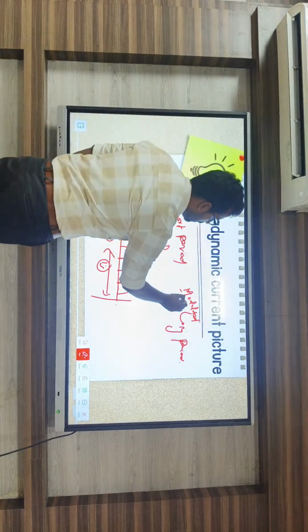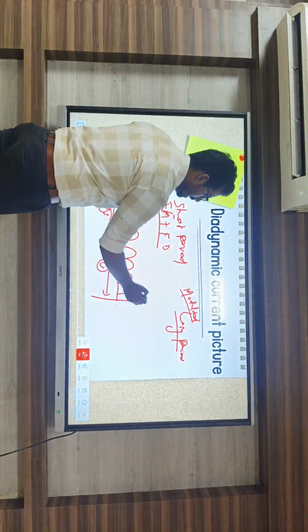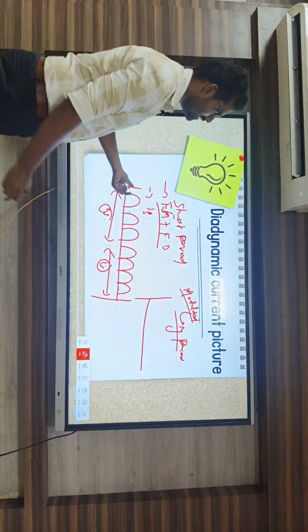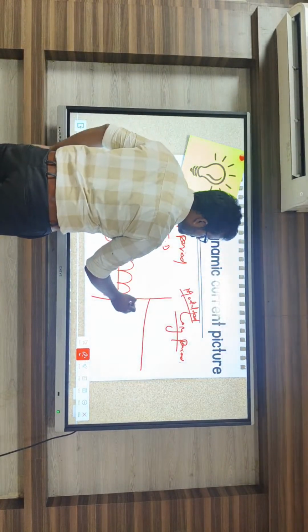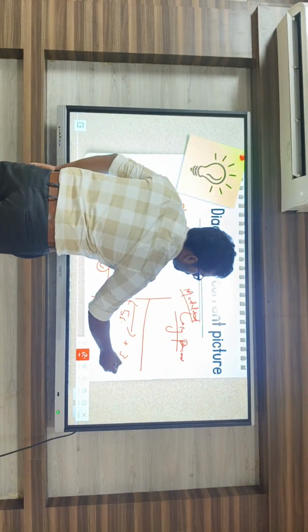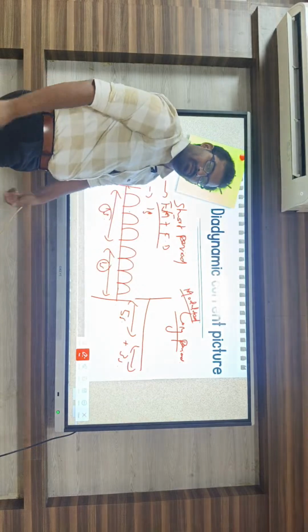So coming to the modulated long period, there is modulation over the frequency level. Totally this is 5 seconds and 3 seconds of the fixed monophase and fixed diphase.